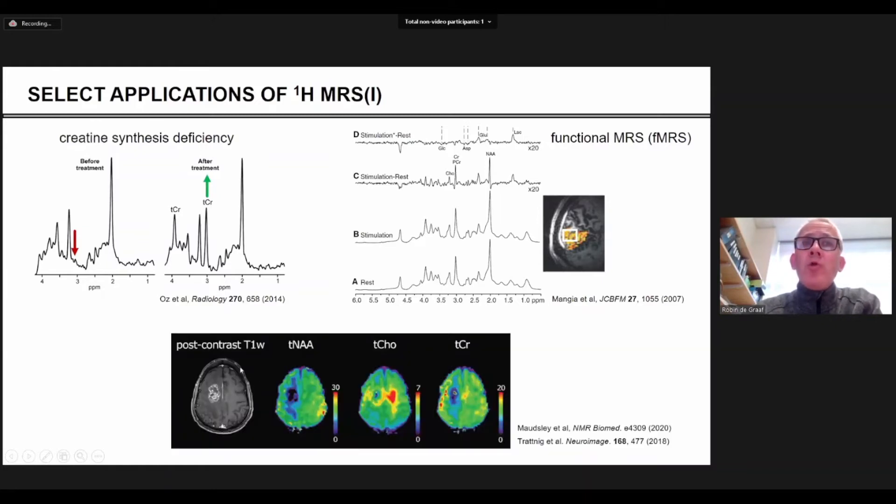You can also do spectroscopic imaging. In this particular example we have a patient with a brain tumor. In spectroscopic imaging you get a spectrum from every one ml volume, so every location has a spectrum like this. You can quantify the NAA signal and then display that as an image. And you can do the same thing for choline and creatine etc. And then you can see in this case the NAA has clearly decreased at this location.